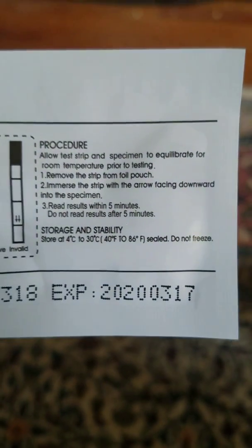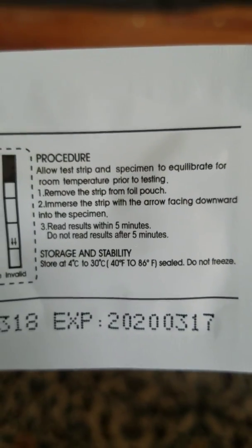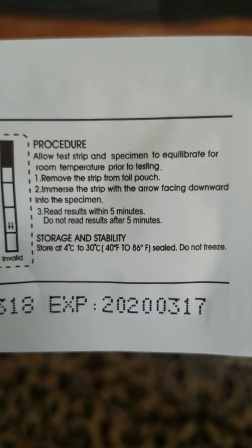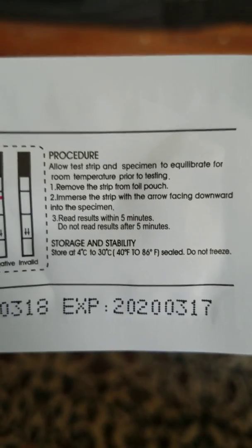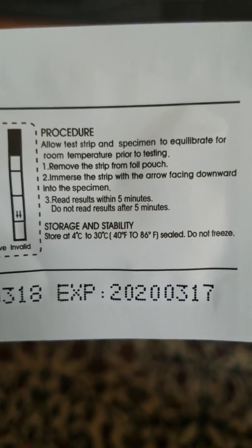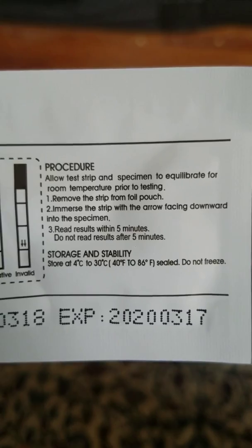The test reads: read results within 5 minutes, do not read the results after 5 minutes. So just letting you know that if you read it after 5 minutes and it's a positive, you're going to have to retest. But if it is a positive before 5 minutes, then you know you're going to have to take one more test just to make sure. You always want to take two of these.